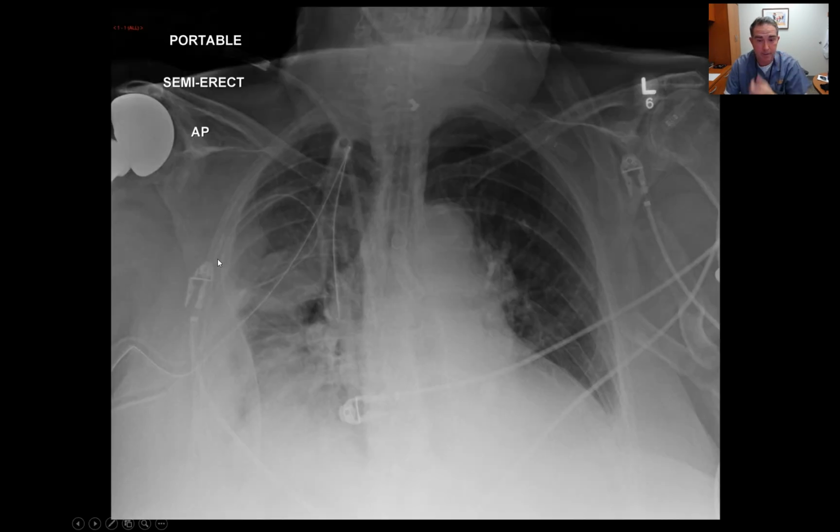This is an ET tube that is intentionally left main stem, but there's a little switch. They can aerate both lungs through that switch, and then they can selectively isolate if they're going to do surgery on this lung to ventilate that. So just to be aware of that device. Has these 2 little rings and this little curve to it. And then if you see that little metal density, that's something that you want to train your eye to pick up.